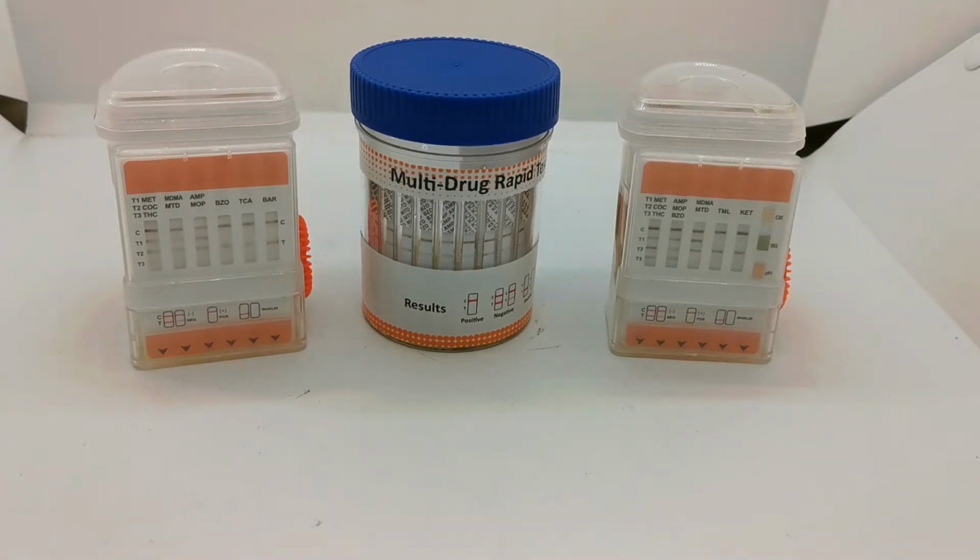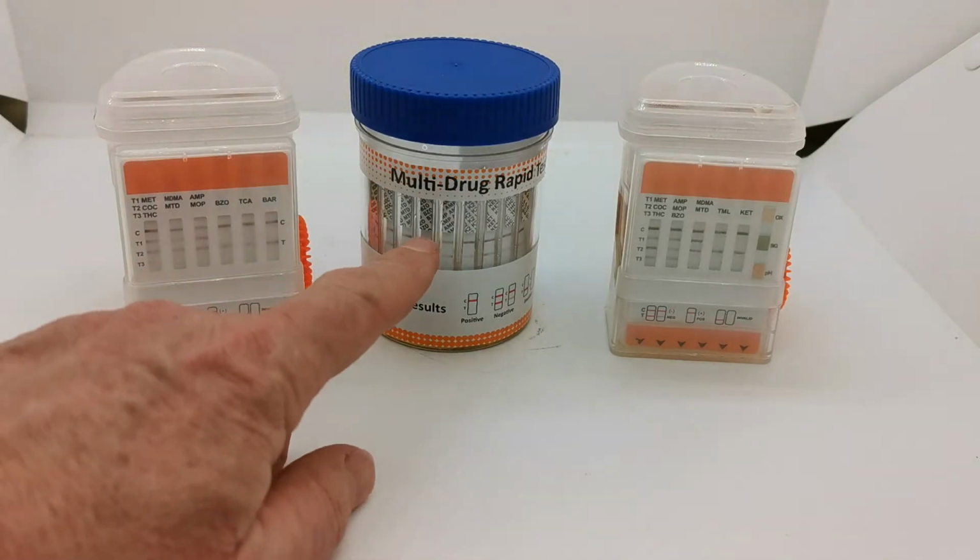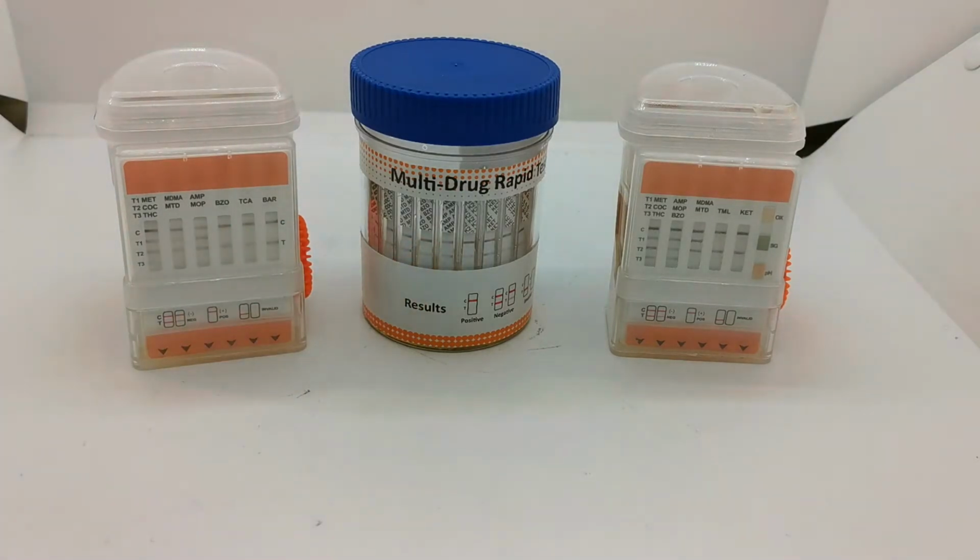Having said that, it is important to note that the sensitivity or cutoff levels for different drug tests can be specified by the manufacturer, and they may not be all identical across different brands. So the first point to note in this video is that the test lines formed may be very different from product to product within a range, and certainly between different products or brands.